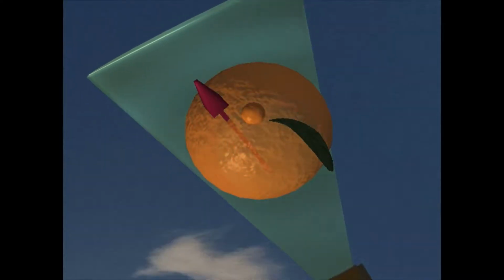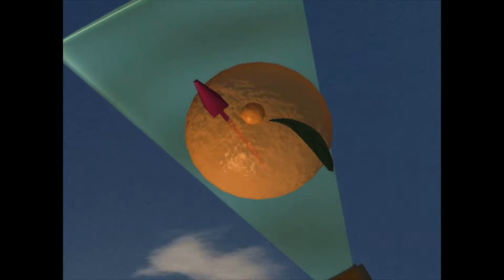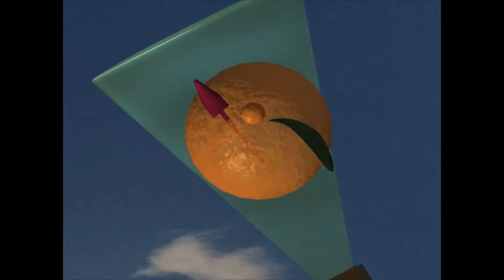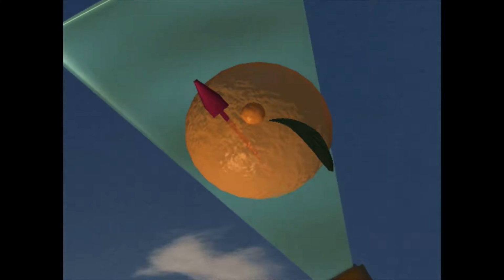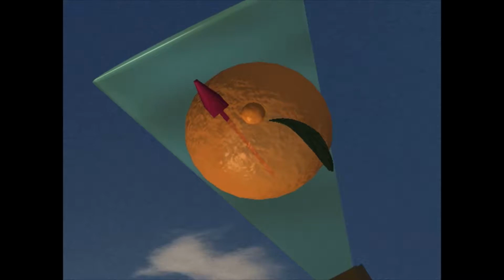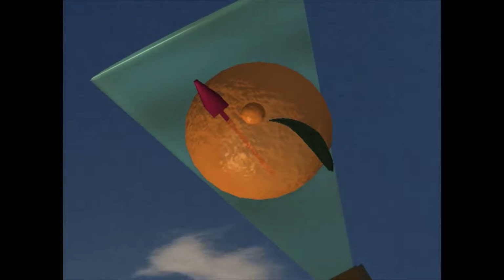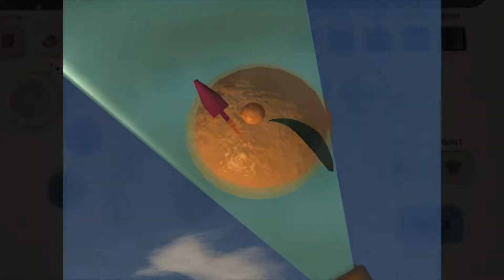Your basic movement with the beam is fanning. You can also rock heel to toe, but fanning is your friend. You will not see the object unless you get the beam across the object, and when you do see the object, you only see a slice of it. The beam is not a camera. It does not show you the whole object. It shows you a slice.